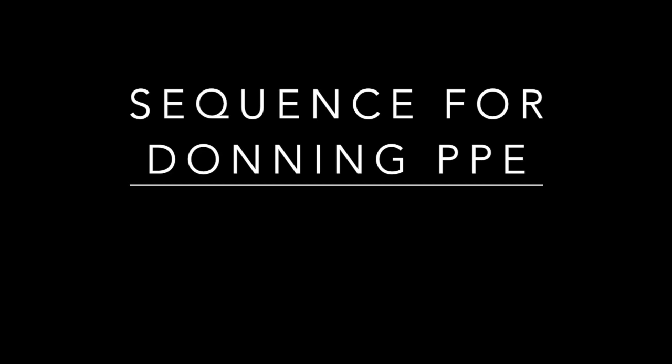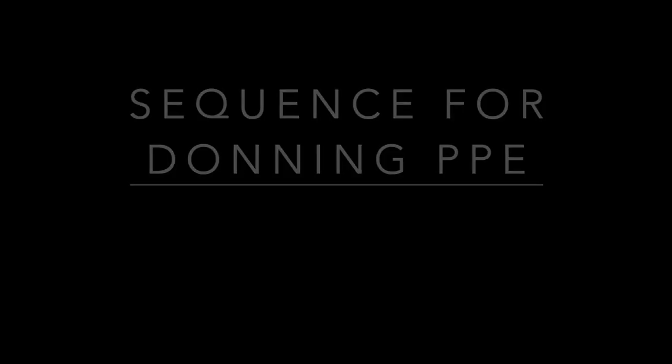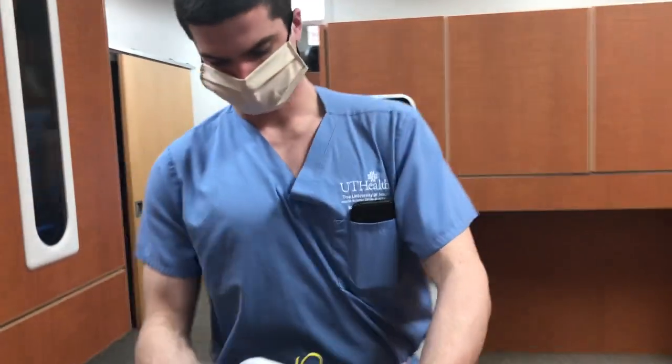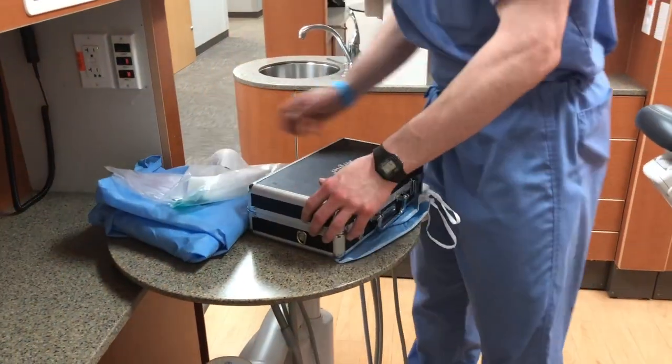Safe and effective use of PPE, or personal protective equipment, requires familiarity with the proper technique for donning — or putting on — and doffing — or removing — the protective equipment. Begin by assembling your PPE to be donned. Donning can be performed in the treatment room itself or in the clinical area just before entering the treatment room.